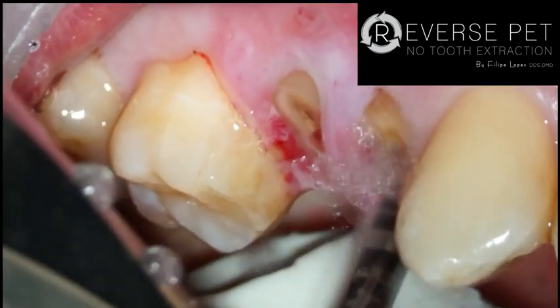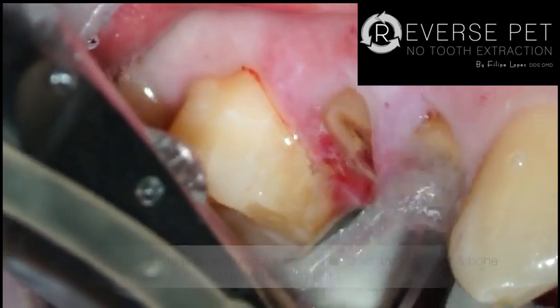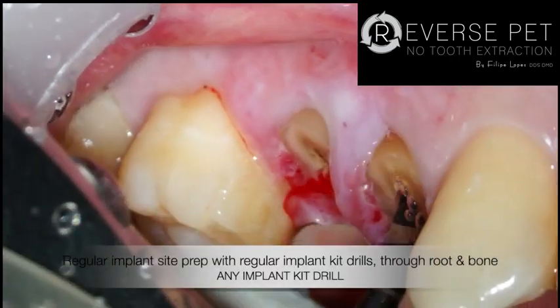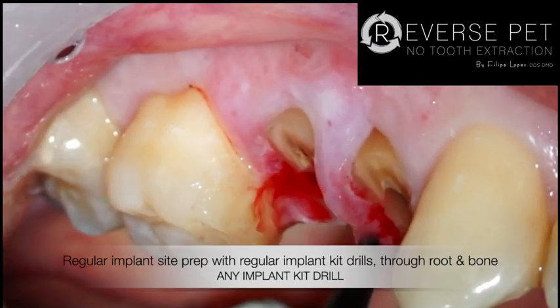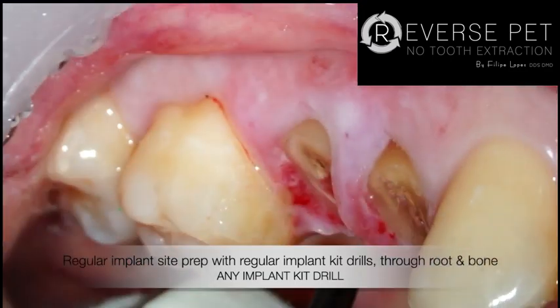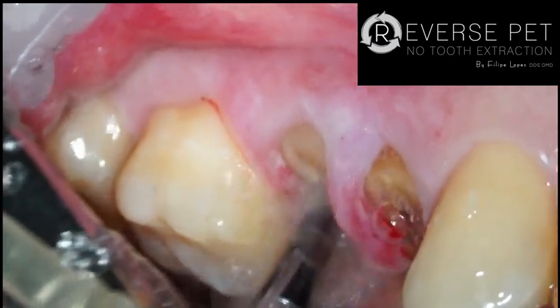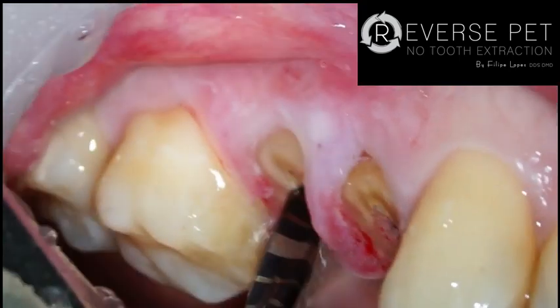So I don't care if it's tooth or not. I'm preparing it to full length, to the length that I have estimated for my implant's length, and I'm doing all the implant site prep. Okay, not all.